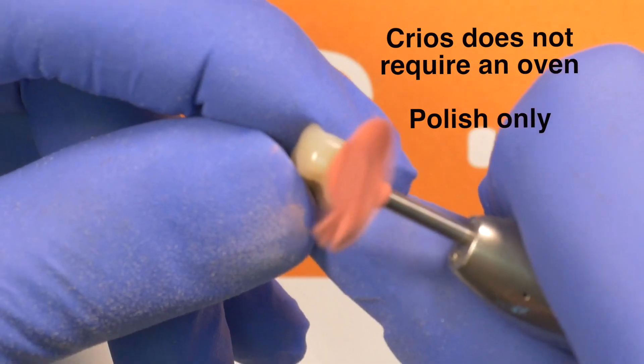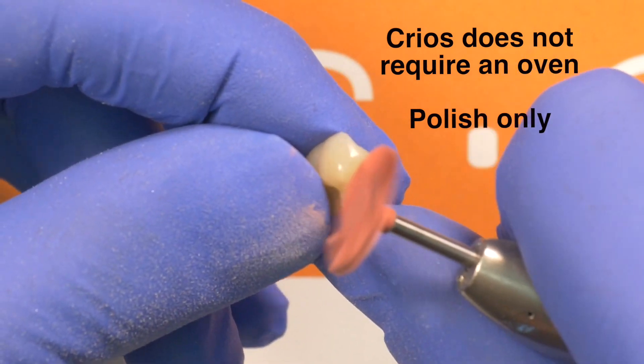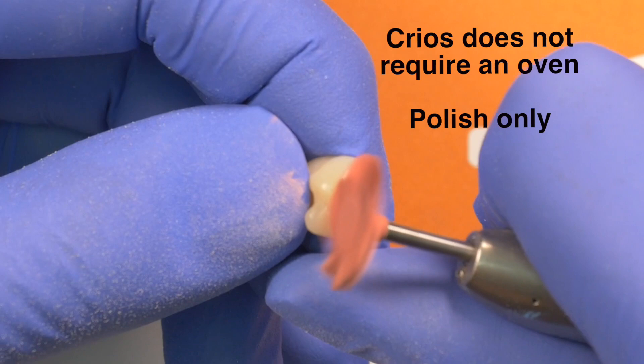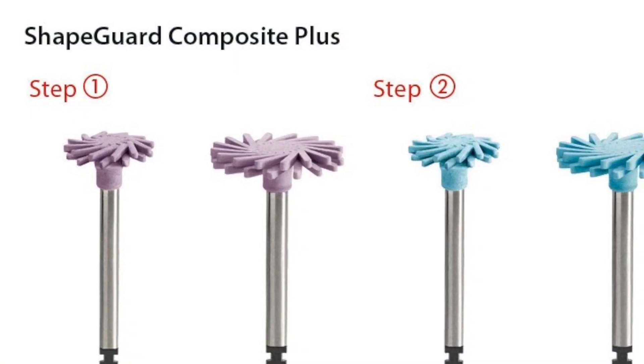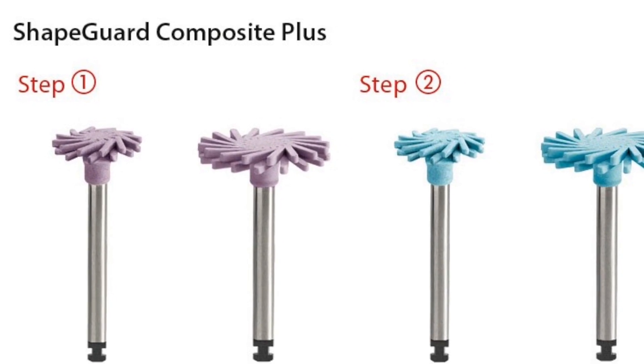The material, due to its composite structure, requires no firing after fabrication and can be polished quickly and effortlessly with a multitude of polishing systems.